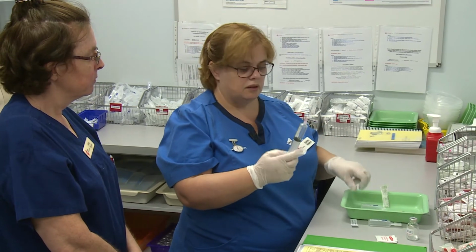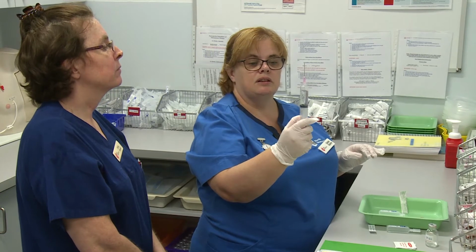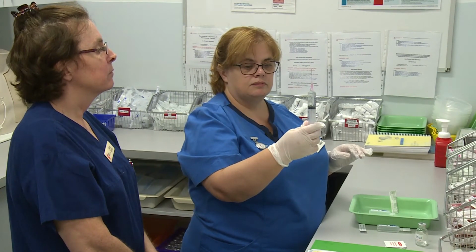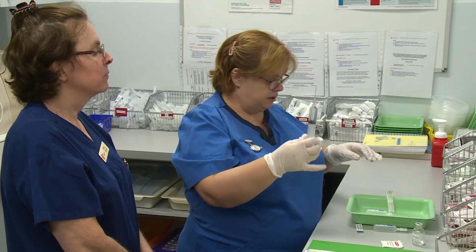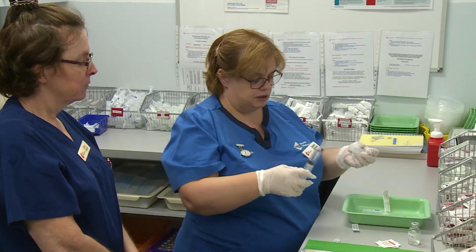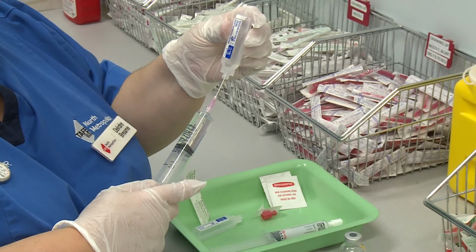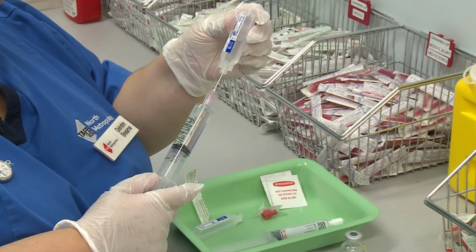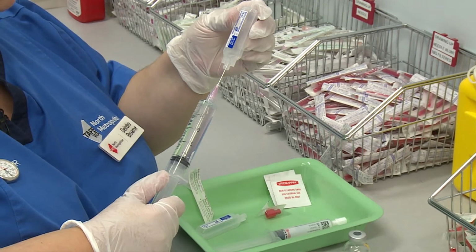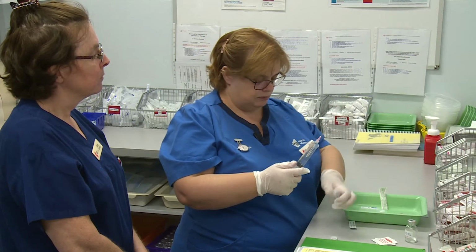Okay, I don't throw that away until after I've administered my medication. I need that for my checks. Make sure I've got my 10 mils. Open my next vial without touching the key part and draw up the next 10 mils of water for injection.